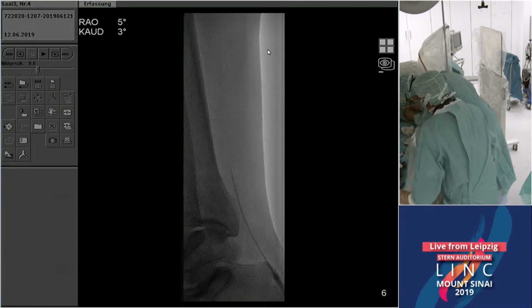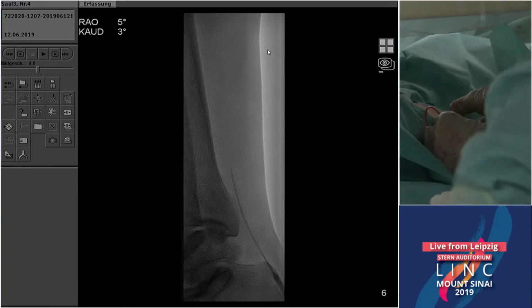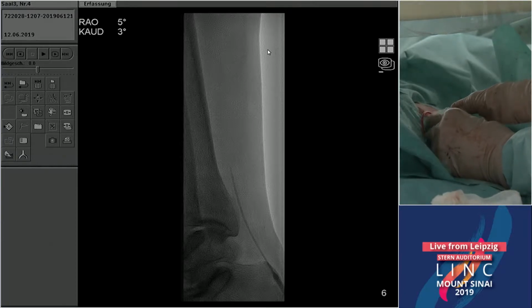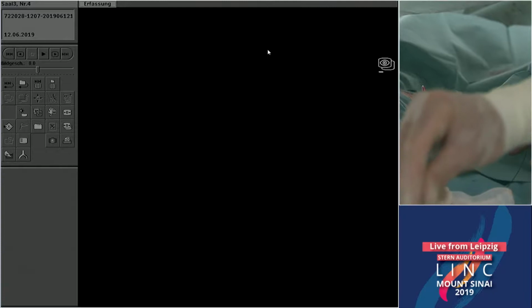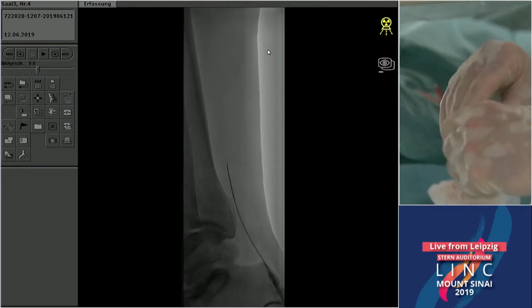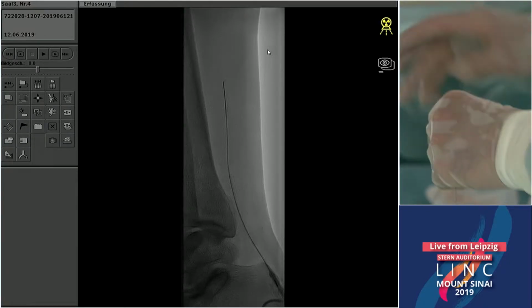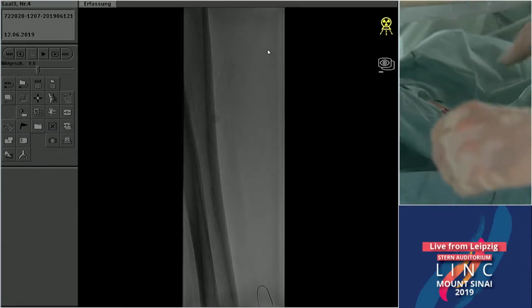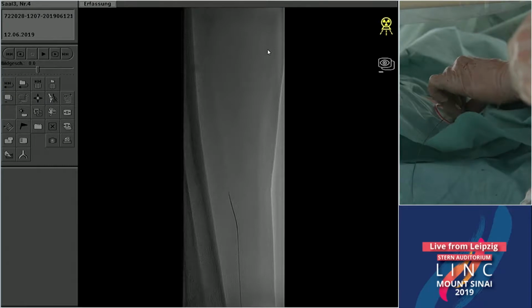Do you intend to use an introducer after that, or a support catheter? Yeah, actually we have now an introducer here directly in the sheath. Maybe Matthias, you can... It's the CXI catheter, which fits nicely through that sheath. I can push it for you. Andre, it's Rob Luckstein. Which guide wire are you using here for your retrograde recanalization?